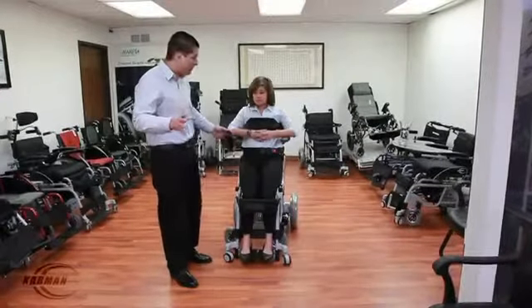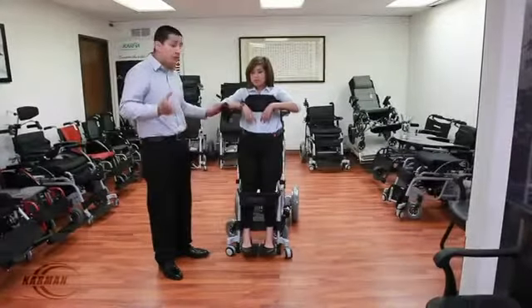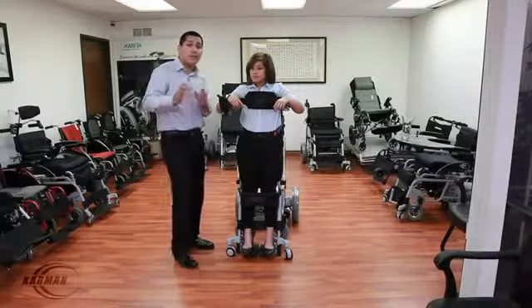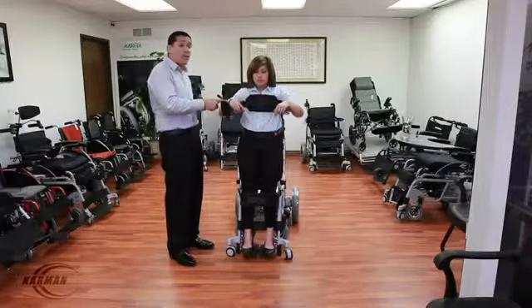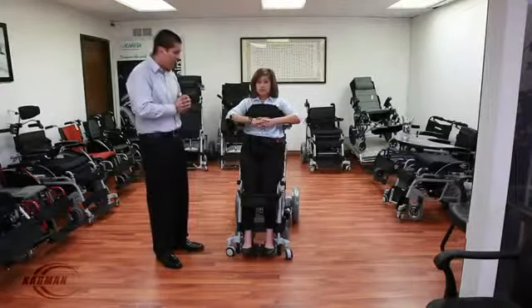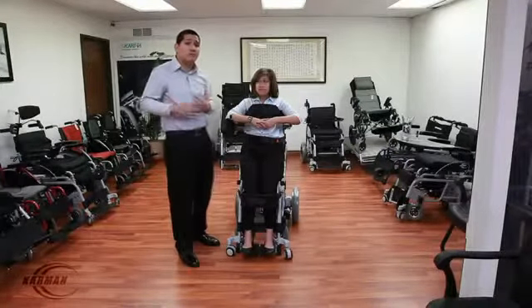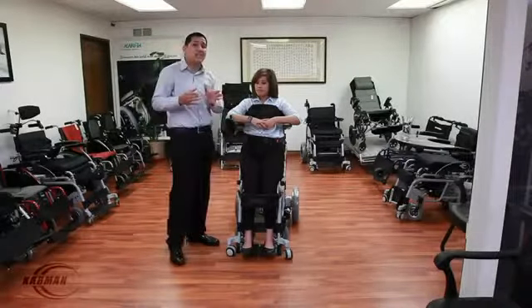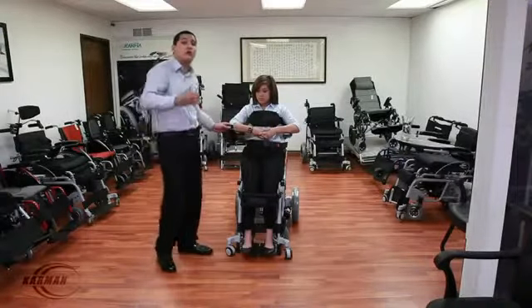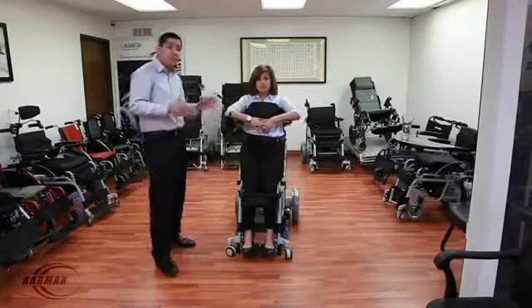In just about 14 seconds, you can go from a sitting to a standing position. It's fairly quick to stand you up. What's great about this is you're able to stop at any point — so if she'd like to relieve a little bit of pressure from her legs or her rear, she can stop at any point. When you first get in a stand-up chair, it may take some time to be accustomed to the fully standing position, so you might want to start off partway and slowly work your way up. This chair allows you to stop at any desired position.